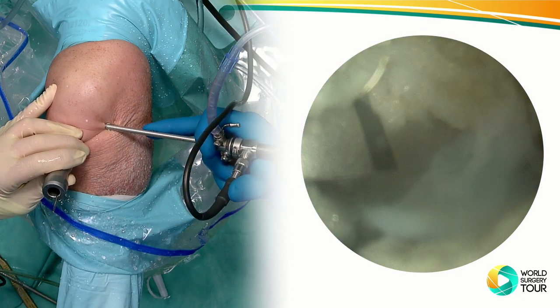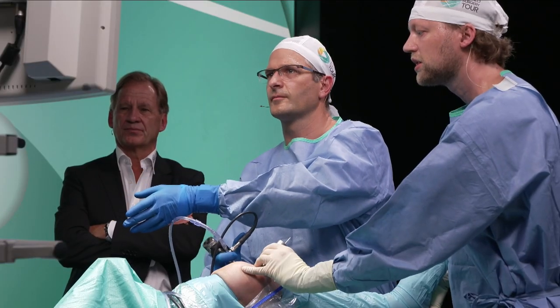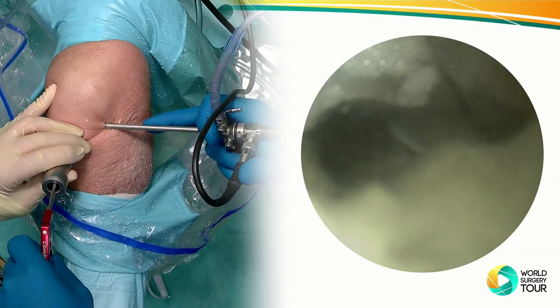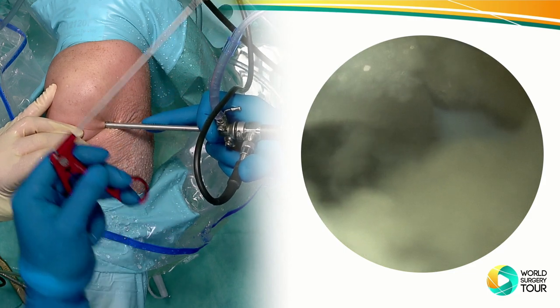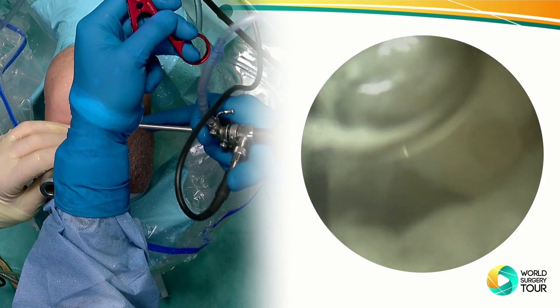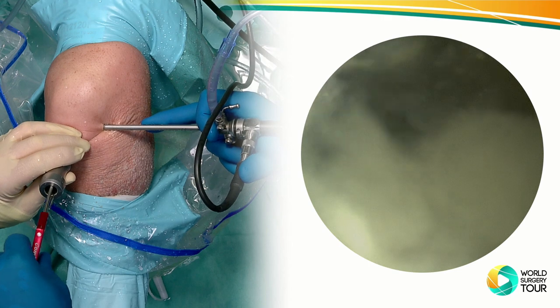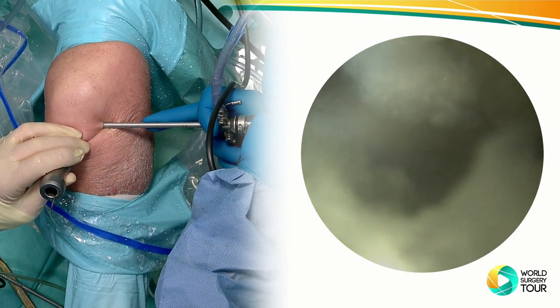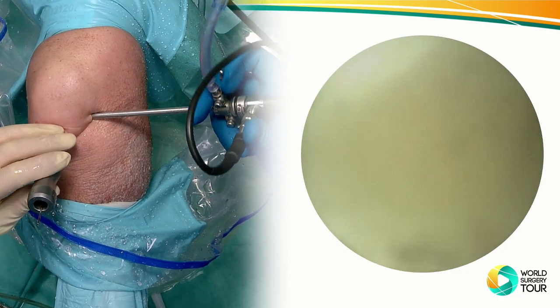Okay, now you see the cartilage here. So now we have already a little bit of cartilage in the reamer. That's important, so we can use this. And additionally, Sven is harvesting the rest of the cartilage pieces. You can see how it comes out. It's going to be collected. Looks really nice. Okay, perfect. Wait, you get more? Okay, oops, sorry, my mistake.